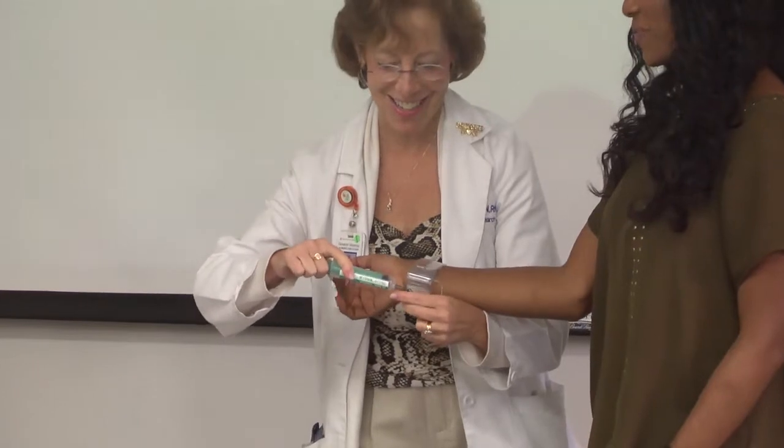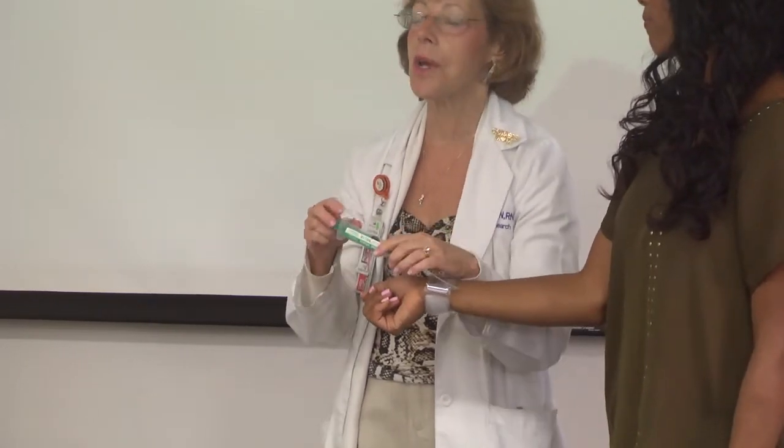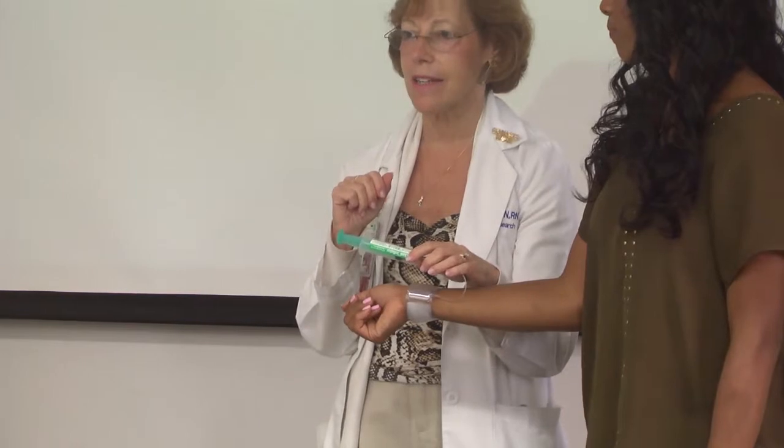So, you don't want to occlude your artery. So you're pulling air out, and a little bit at a time. You release 2 to 3 cc's at a time, and see if there's bleeding or not. Wait 15 minutes, release another 2 to 3 cc's. If there is bleeding that occurs, you're going to put that 2 to 3 cc's back in. Once you're totally done, and this comes off, if the patient starts bleeding, you do not put this back on. You're going to call the fellow or APRN that's on call.